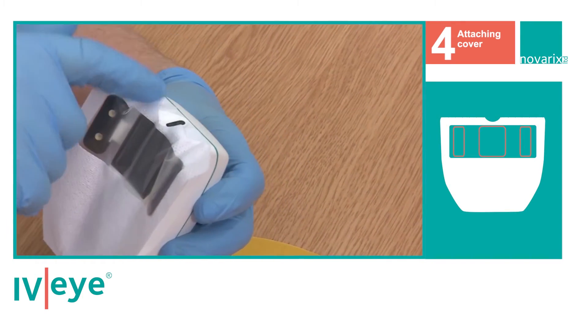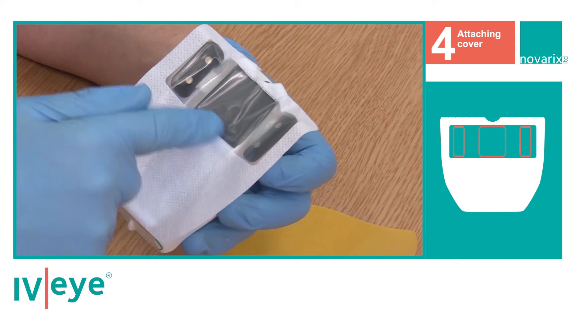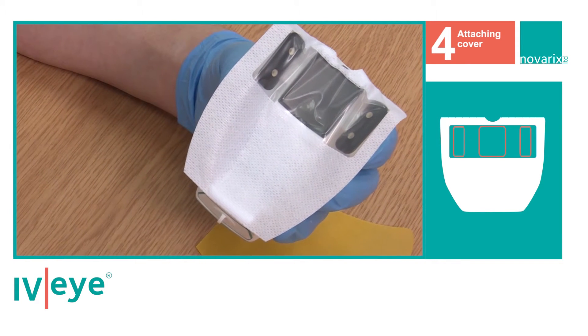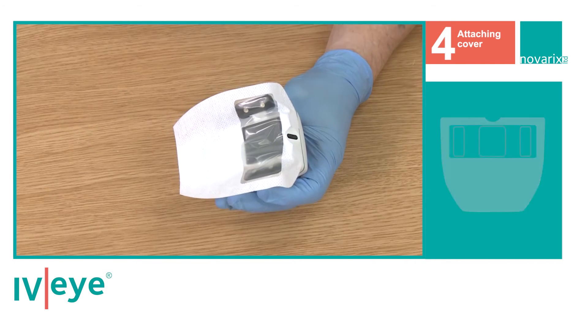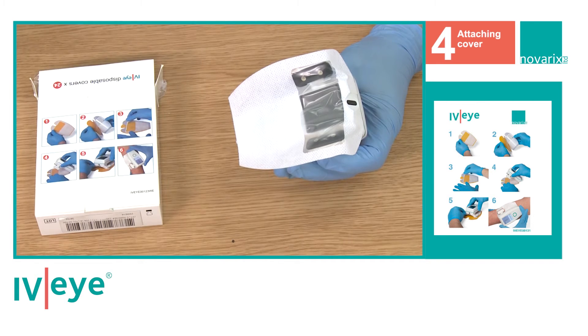Ensure the front wings and the camera window are clear and sited within the disposable cover window. The device is now ready for use. These instructions are shown on the back of the cover box and on the simple-to-use user guide.